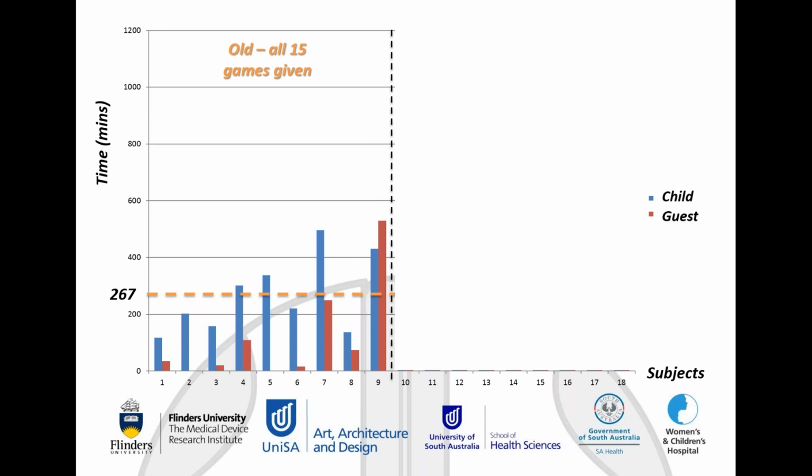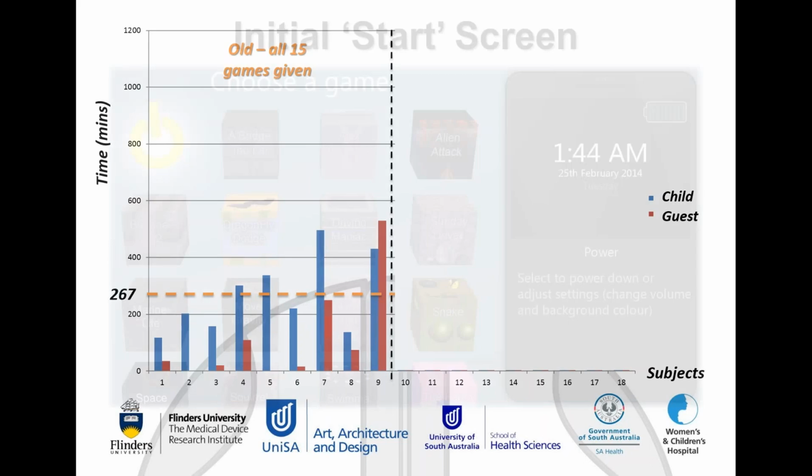So what we did was we implemented a very common strategy, and usually this is where I look around the room to see who might be looking up at me with the next thing I'm about to say. But if you've ever played Candy Crush or Angry Birds or any of those other games, you'll know that a very common ploy to get people playing games is actually the reward system. So if you play games for a certain amount of time, you get rewarded by getting to the next level or the next game. So we decided to do the same thing with our gaming system.